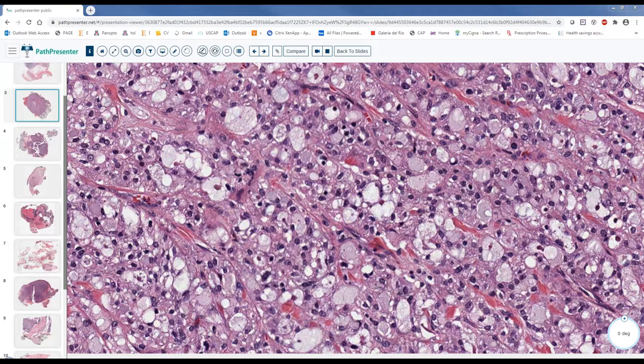All right, Mariam, you got it. You are the winner. Mariam got it. It is DOG1. DOG1 should be negative.